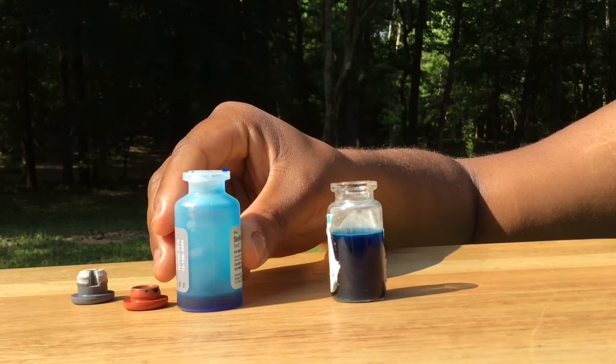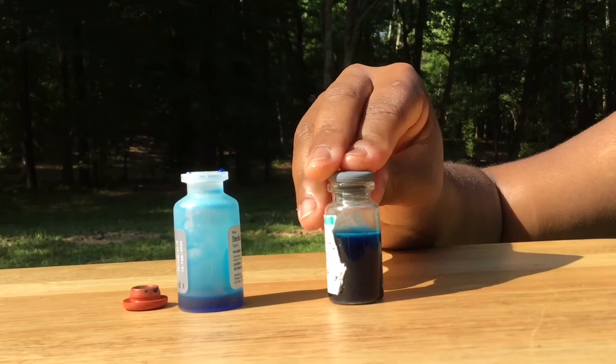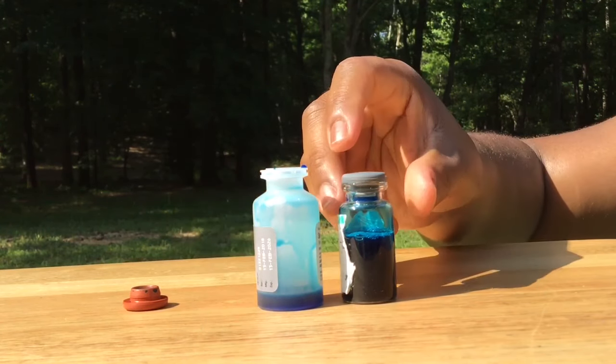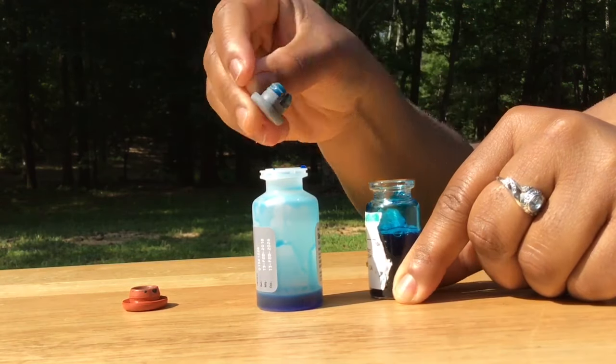Put the lid back onto the vaccine bottle and shake the vaccine bottle for the length of time listed in the instructions provided with your particular vaccine. Then take the lid off the vaccine bottle and pour the contents back into the diluent bottle.